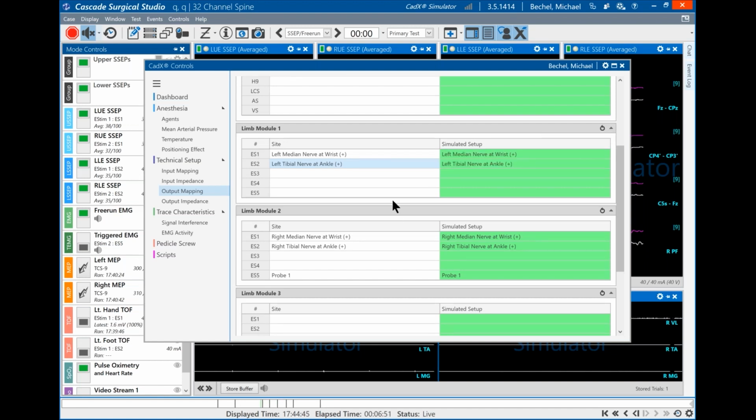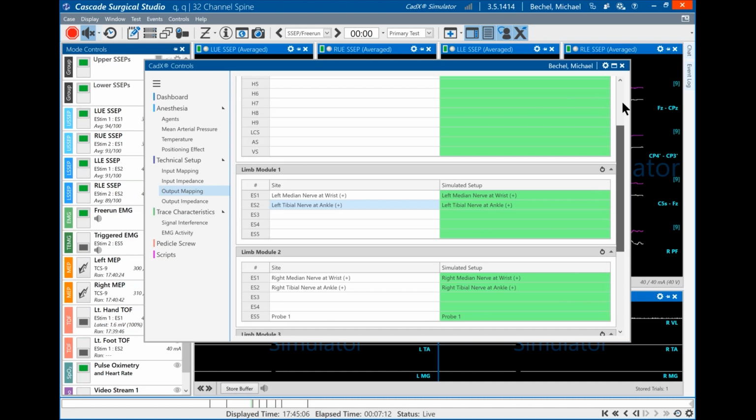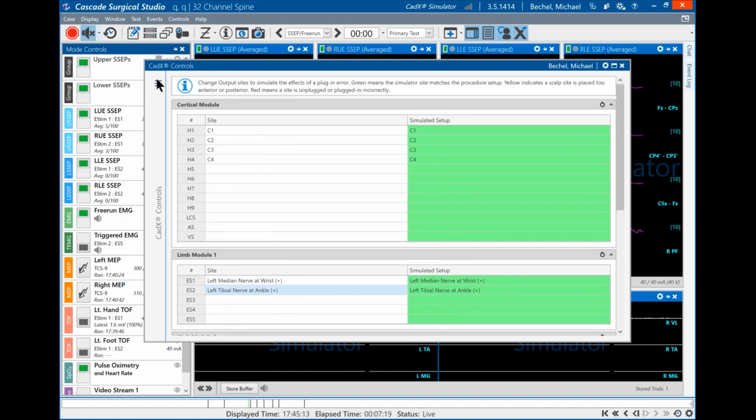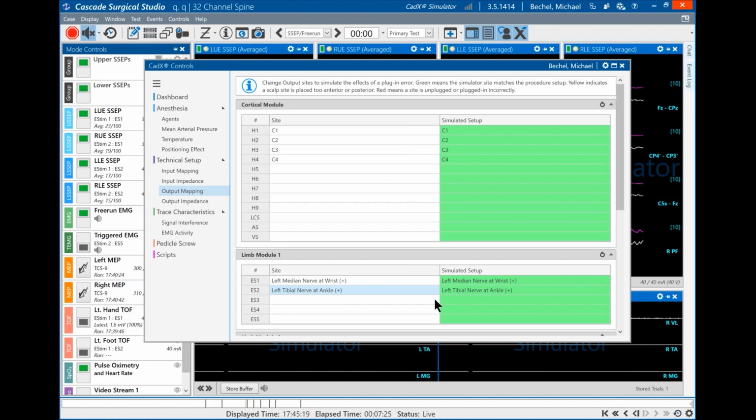Can this be hidden from the person you're testing? And in fact, it can be. You can have a trainer-student scenario, or a teacher and an assessee scenario, and you can hide this so you can make changes to it. And then there's actually an assessment mode that will allow you to check off whether these various scenarios were adequately or accurately identified by the person you're assessing.